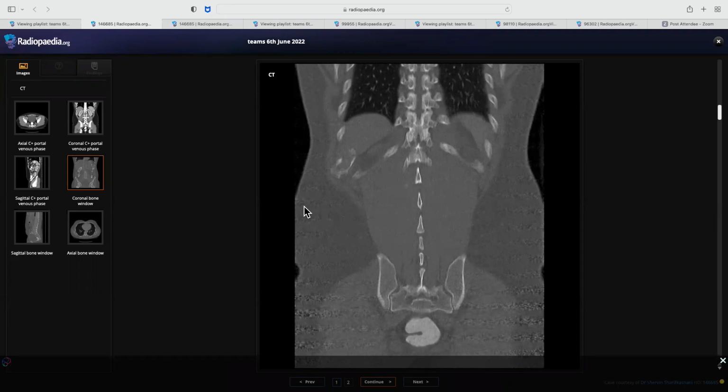What are the other characteristic appearances of fibrous dysplasia? For example, if there is an X-ray of pelvis, what would you see? Then I'll be looking for the classical Shepherd's crook deformity in the femoral neck. The classical appearance is usually ground glass matrix with the expansile lesion.